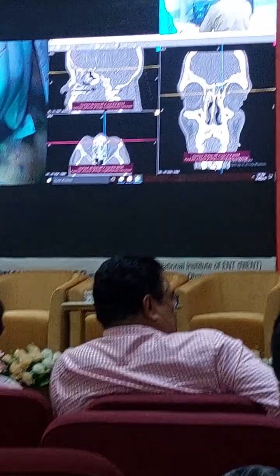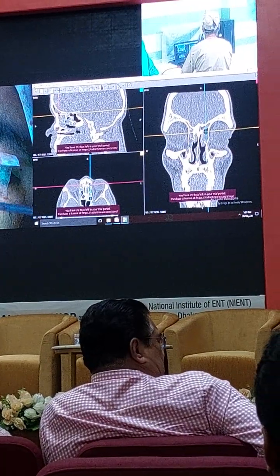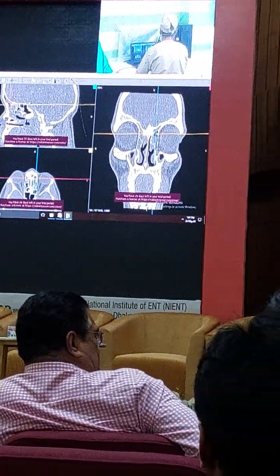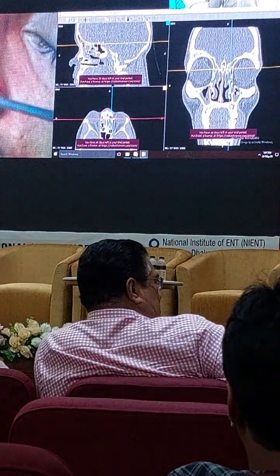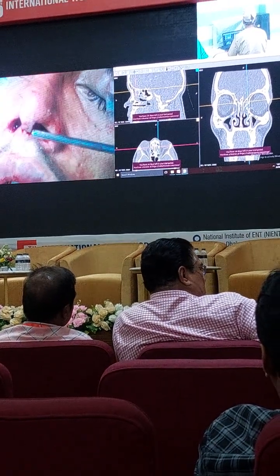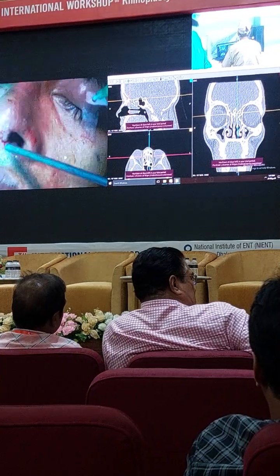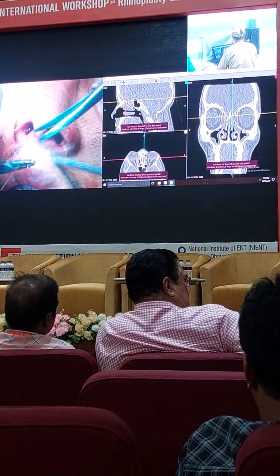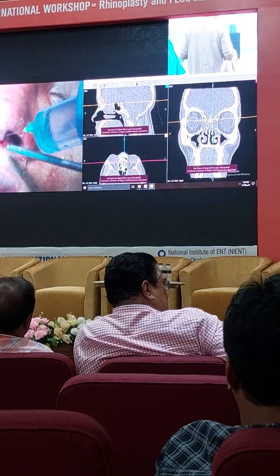so that's maxilla. This is the nasolacrimal duct coming into view. So nasolacrimal duct now going to open into the inferior meatus. So exactly at that point you will start seeing the uncinate process. Okay? So now you see, let's move this line a bit. You see the uncinate process, and the uncinate process is rotated medially. And you have the opening of the maxillary sinus.